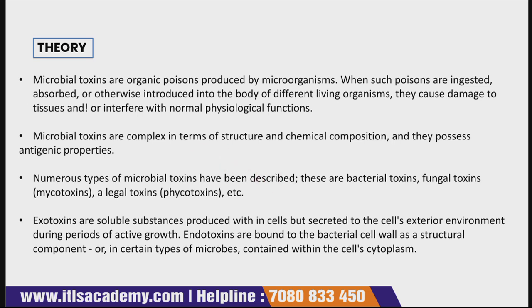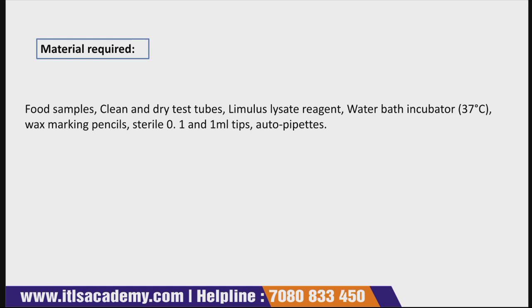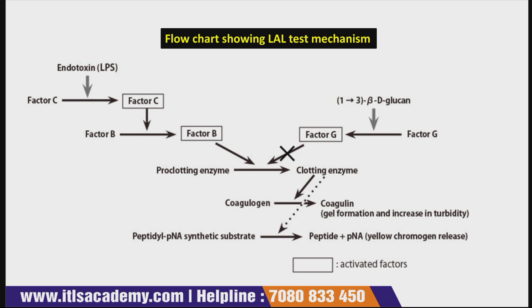Now let us move further and see the flow chart of the LAL test mechanism. You can see in this flow chart how the endotoxin, that is LPS, acts. This is the whole LAL test mechanism. Before understanding the material required, let us quickly see the flow chart showing the LAL test mechanism.